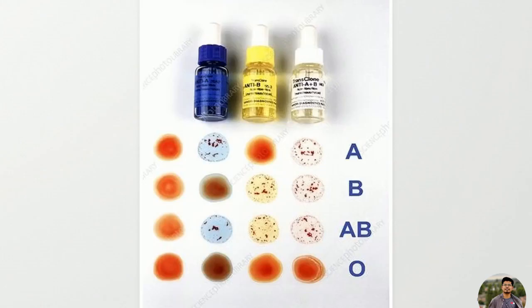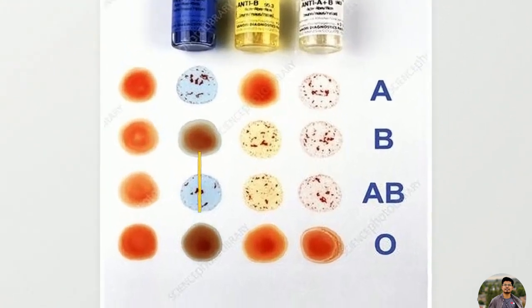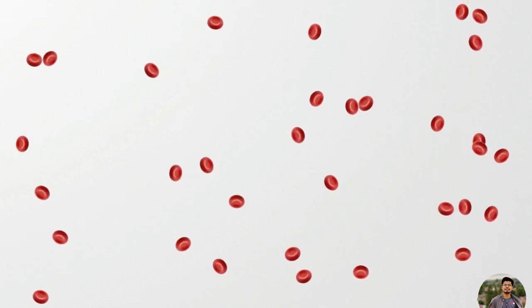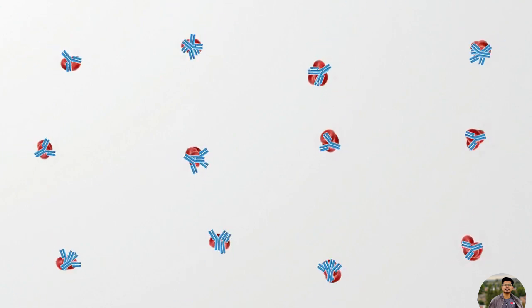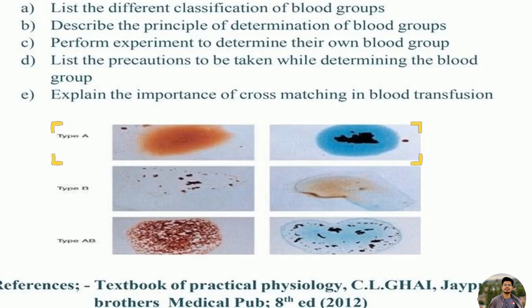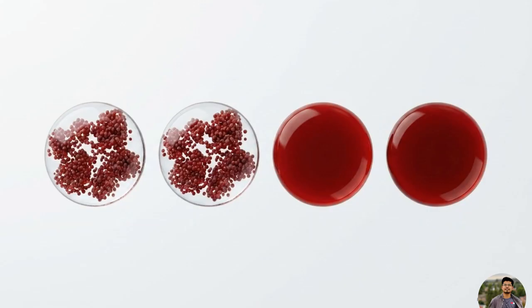Take a look at this reference chart showing exactly what hemagglutination looks like. A negative result remains a smooth, uniform red puddle. A positive reaction clumps together, looking like cracked pepper or distinct speckles in a clear fluid. The interpretation rules are straightforward. Clumping in the first drop indicates the presence of antigen A. Clumping in the second drop indicates antigen B. If both drops clump, you have type AB. If neither drop clumps, your blood is type O.